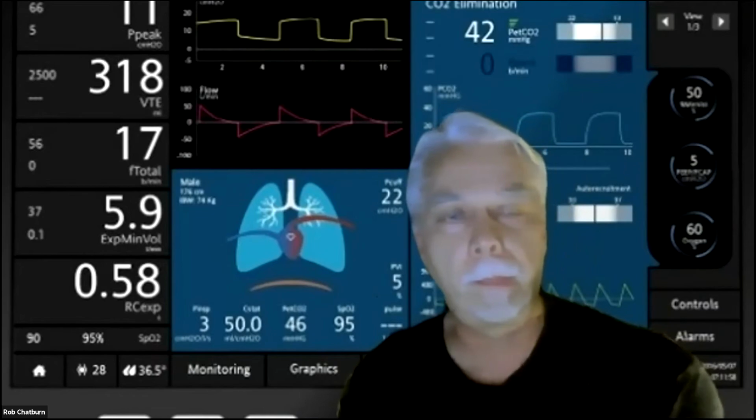So it's going to be another decade before we get answers to questions like that. I also think what Marini is showing in this paper, just scanning through, is really nice. One of my skepticisms of the power has always been that it is that unit of time, that it's basically an average of the power over a minute, but what the lungs actually experience, how the lungs experience that power.